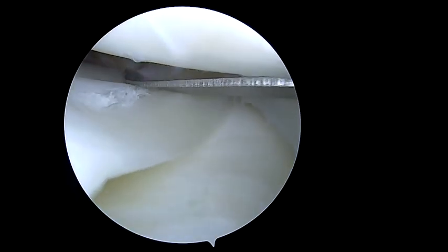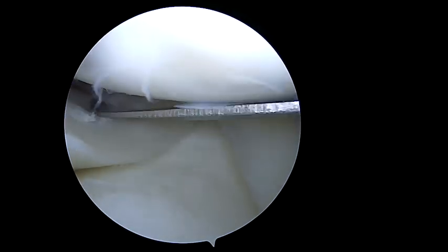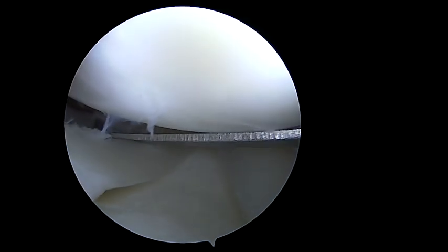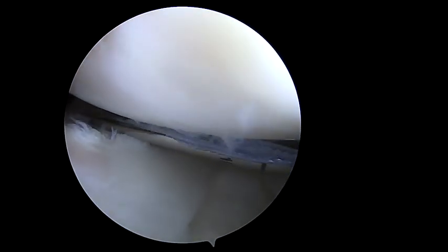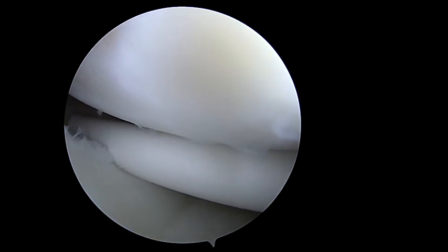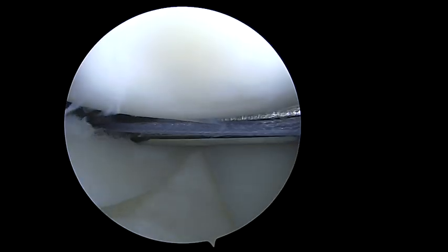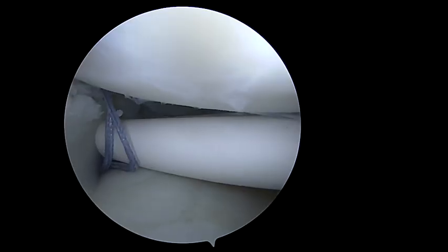It was noticed that a slight upward bend at the tip of the skid helped to facilitate an anatomic reduction of the meniscus tear. The modified skid was introduced into the knee and was easily able to access the peripheral aspect of the meniscus tear, and a downward pressure applied by the skid provided reduction of the tear to achieve anatomic fixation. Two 1.5 fiber stitch sutures were then passed using the skid and allowed for excellent compression and stabilization of the lateral meniscus tear.